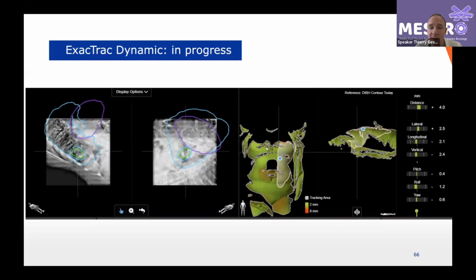We have a long history of motion management, and we know that the patient can drift. Lung patients sometimes have problems holding their breath and so on. So we know that they can drift during the treatment. So we need a solution so that we can analyze whether or not during treatment we can see the lesion and continue treating. That is why we are looking at this now; it's purely research, not a commercial product yet.